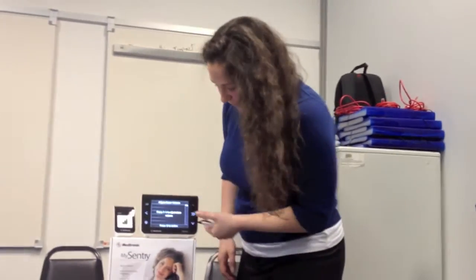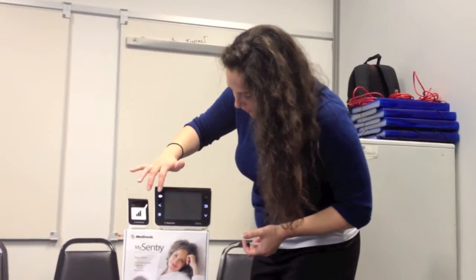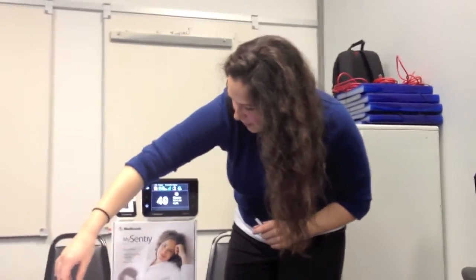That'd wake me up. All the way up, we can get all the way to that. And that's what it would sound like if it was actually... Wait till you hear the alarm. So that's what we're going to do next. So trying to get a low alarm here. So we'll keep pushing it a little bit lower. How was that? I know.